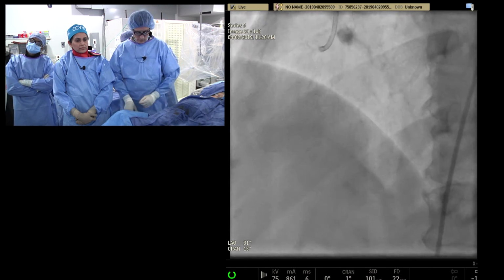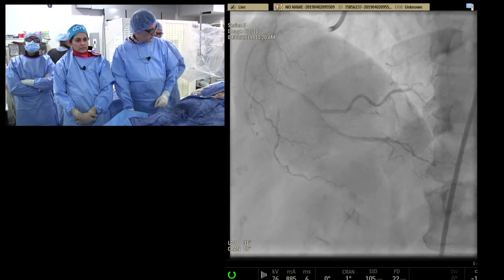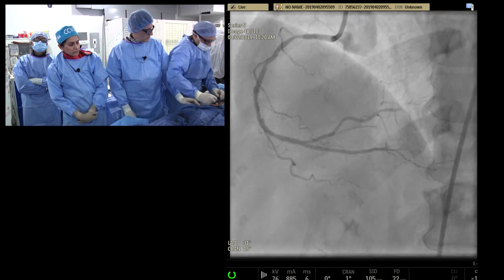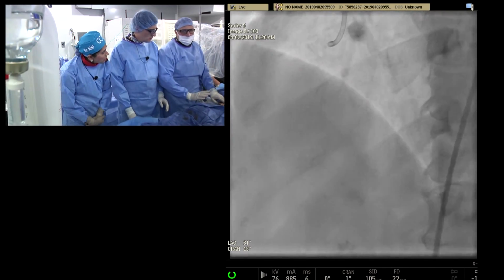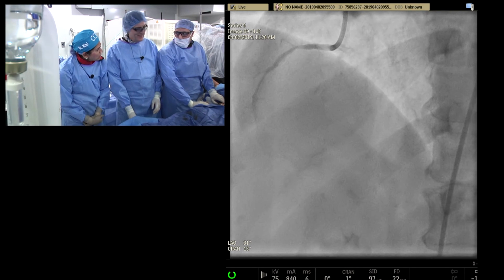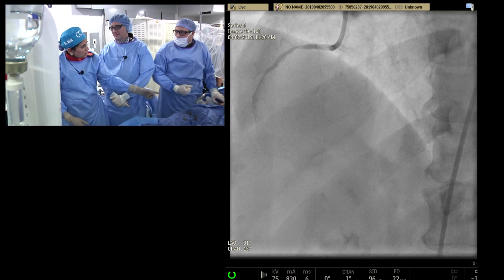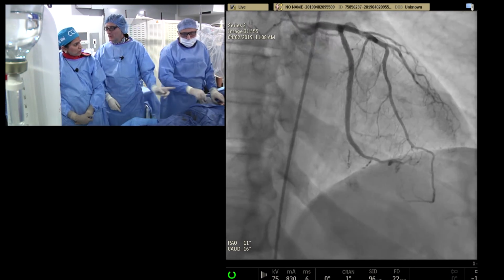But they mitigated these risks by using intravascular ultrasound, making sure they got a great result, and then measuring the platelet inhibition on clopidogrel to make sure that she has a very good steady state of paralyzed platelets, which is what they showed with their platelet reactive units. I hope that makes sense to all of you.